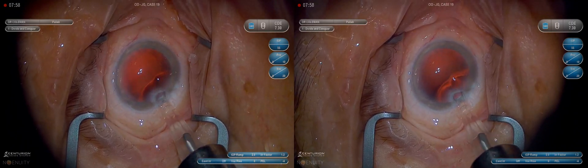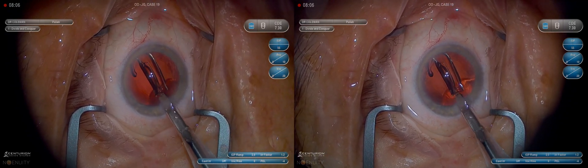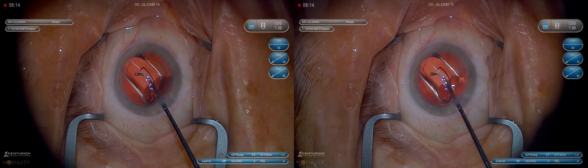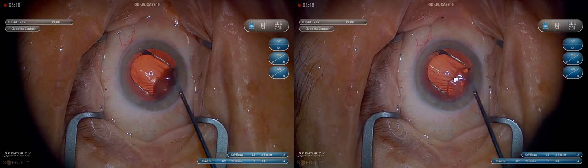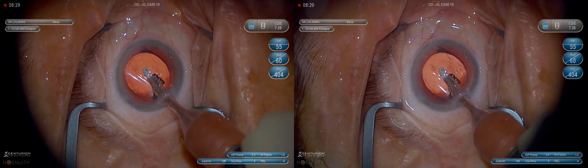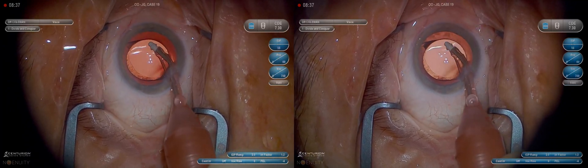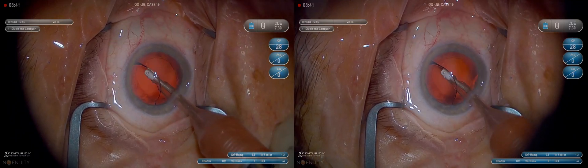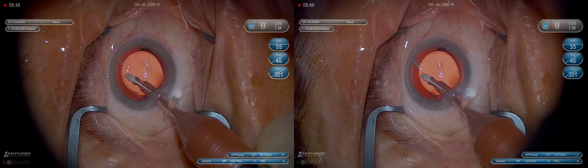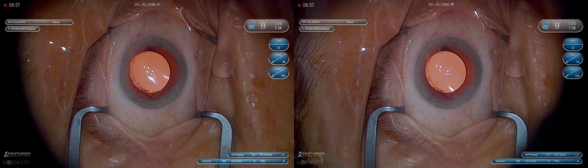I go in bevel up — I think that gives me a little more control of the eye without having to use a second instrument to stabilize. Make sure the leading haptic is in the capsular bag. We're going to push this lens straight down with the chopper, get the haptic going out towards the equator, and make sure it's in the capsular bag. I usually remove the viscoelastic in the anterior chamber first, then slide the lens over by pushing down on it as I gently touch. Once I can get around the edge, lift up. When we're using the IA tip, if we're looking down the bore of the port, it's very unlikely to grab capsule. When it's tilted to the side and we can't look directly into it, that's when we're at risk of grabbing posterior capsule or iris.